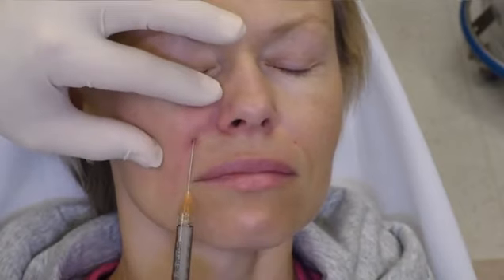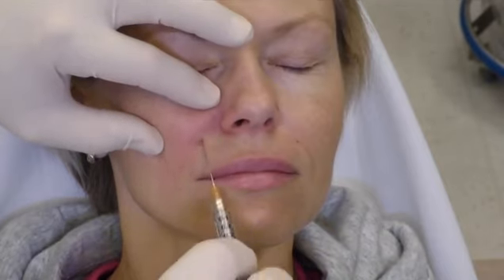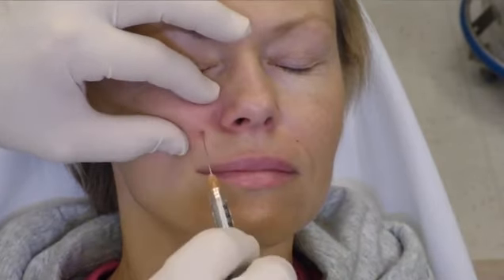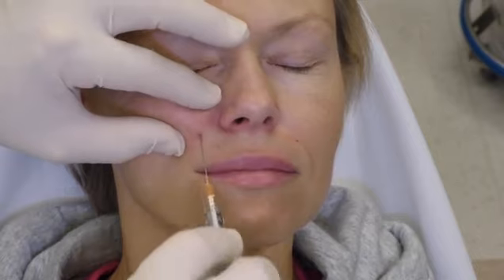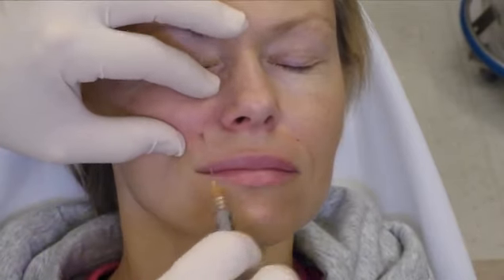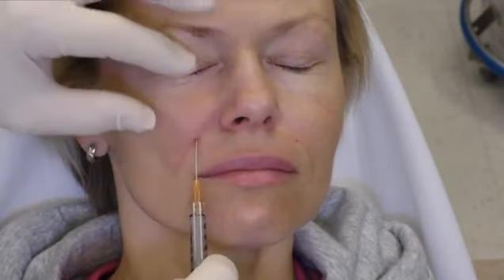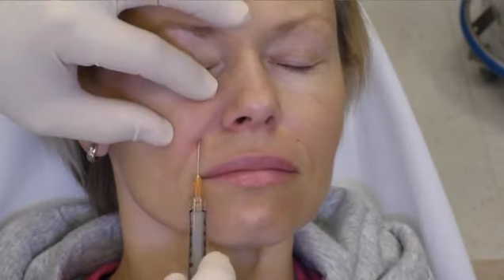This access port likely is at the lateral bounds of both the premaxillary and the peripiriform spaces. Once the space is entered, the cannula will advance easily in a cephalad direction up to the tear trough retaining ligament.